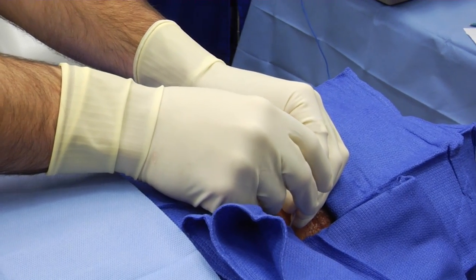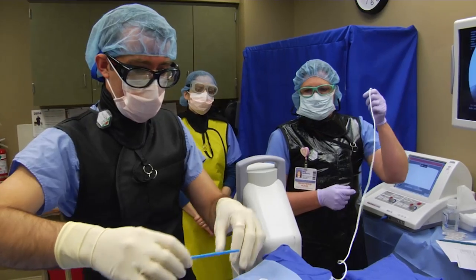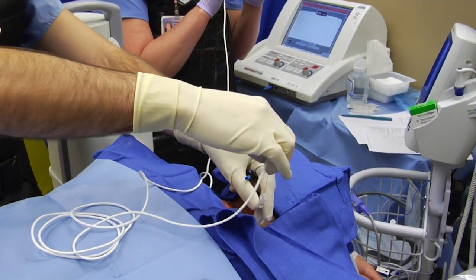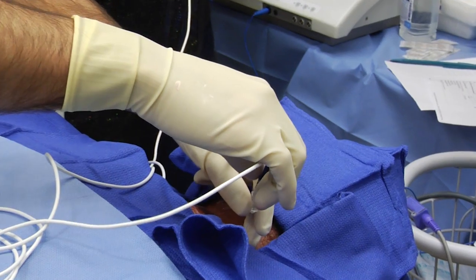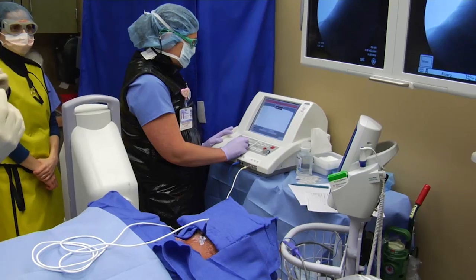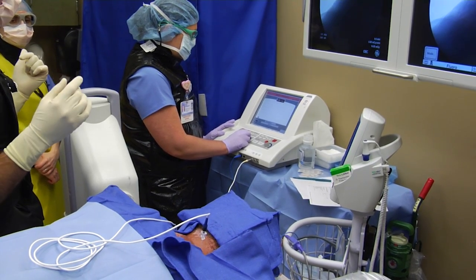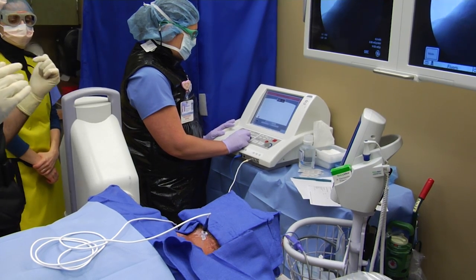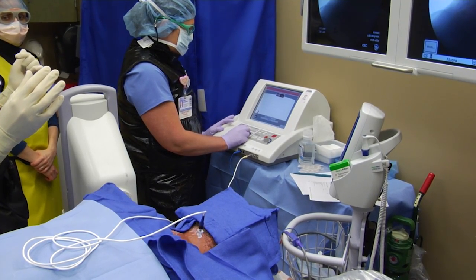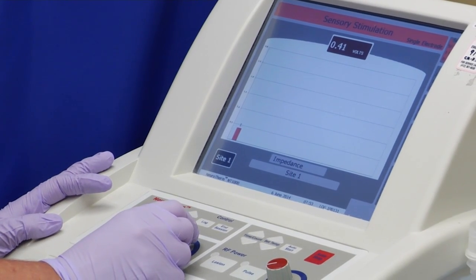At this point, we will perform the sensory and motor threshold testing. I remove the inner trocar from the needle and place the inner radiofrequency cannula, always making sure the needle tip continues to rest on bone. The radiofrequency needle we are using has a 1-centimeter active tip. The two stimulation strengths we are using are 50 Hz for sensory fibers and 2 Hz for motor fibers. The 50 Hz sensory stimulation is utilized to determine proximity of the active tip to the third occipital nerve. Theoretically, the closer the active tip is to the third occipital nerve, the less voltage is required. My assistant is slowly increasing the voltage until the patient begins to feel either a pressure or buzzing sensation in their symptomatic area of pain. Once they feel that sensation, the required voltage is recorded.